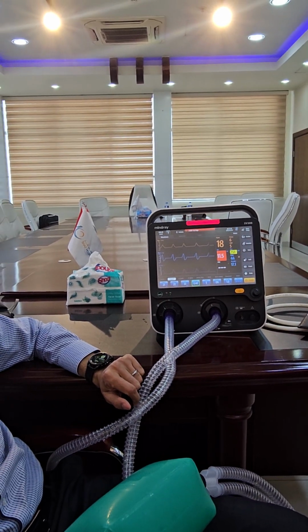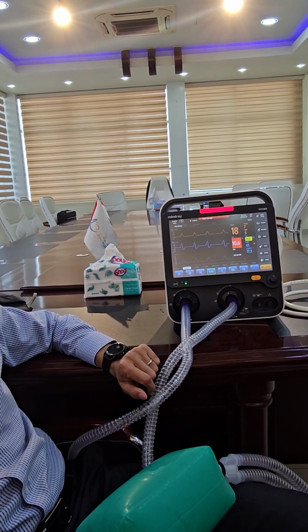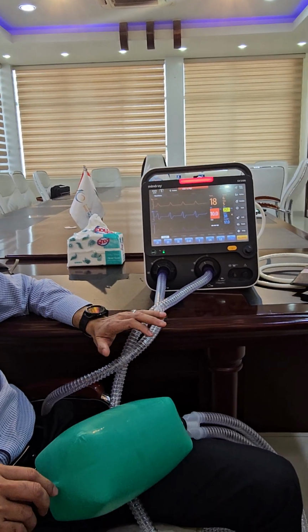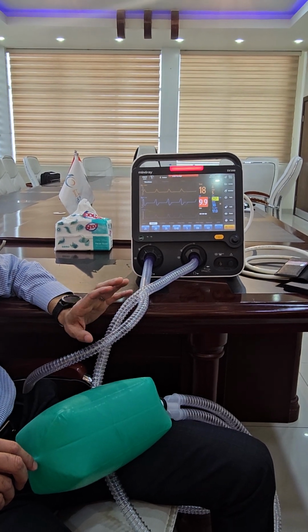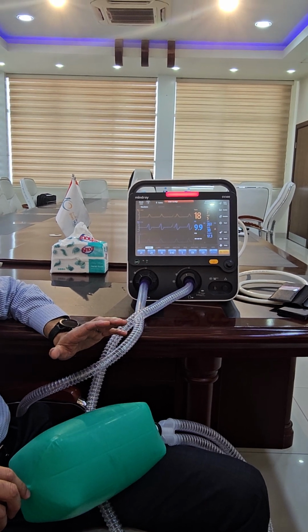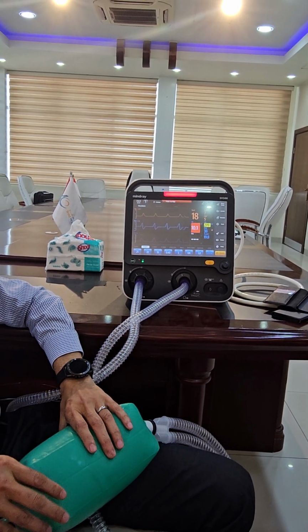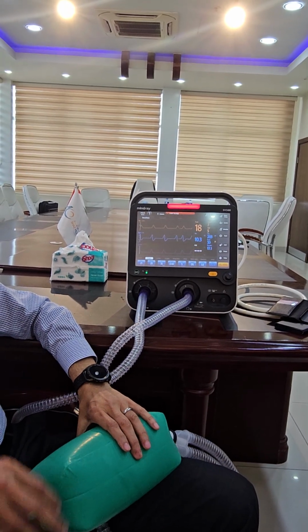35 times 0.40 is 14. If we put the ratio 1 to 2, the exhalation will be 14 times 2, which is 28. Plus 14 for the inspiration, 42. So we have 42 for both inhalation and exhalation, and we can make the IE ratio 1 to 2.